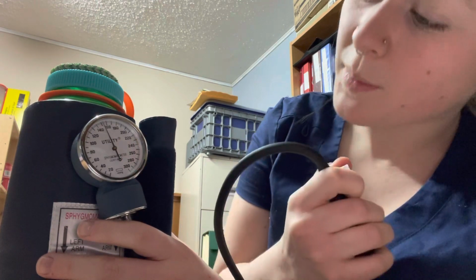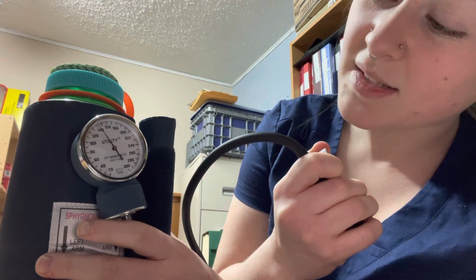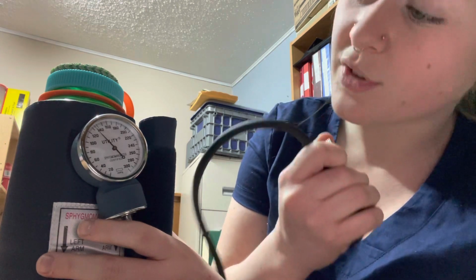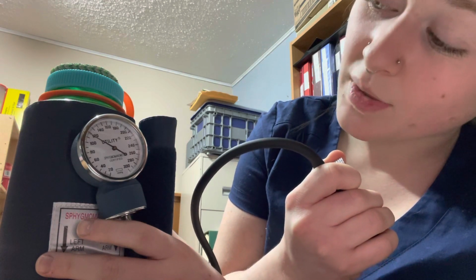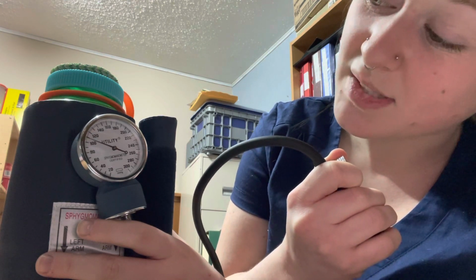Then I'm going to use the pump again to slowly let out. This is when I would have my stethoscope placed under the blood pressure cuff and listening for sounds. When I hear the first sound, that is the systolic sound. That's systolic. This is when I have to make sure not to have any big sudden drops, dropping 2 to 3 millimeters per second.